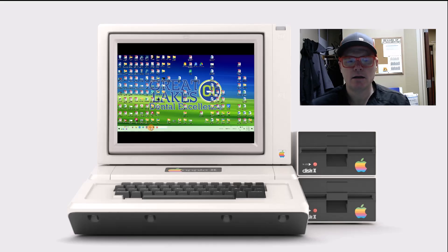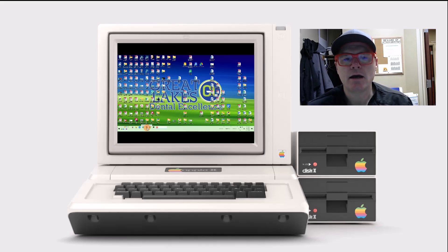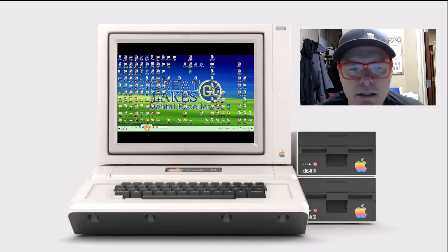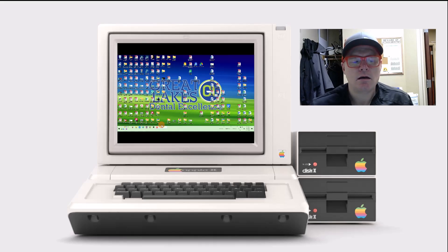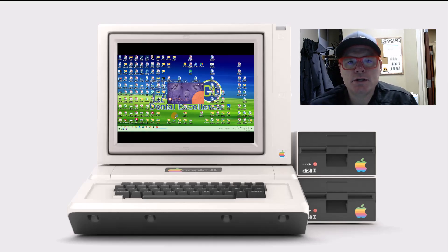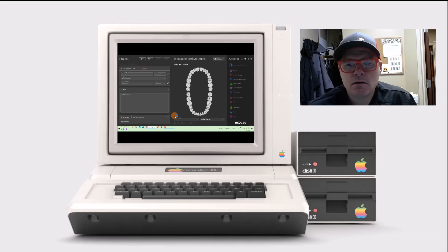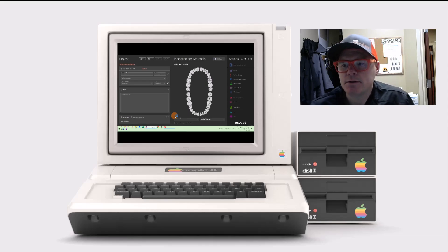Hello ExoCademy. We are going to go over the cloud AI functions in ExoCAD today. With the new version 3.2 of DentalDB and DentalCAD, we have AI crown design that's enabled.